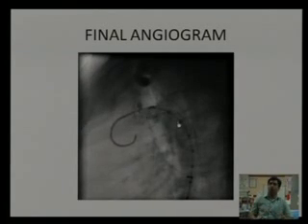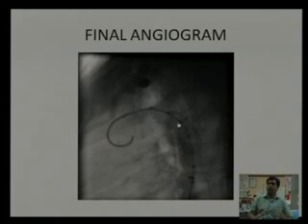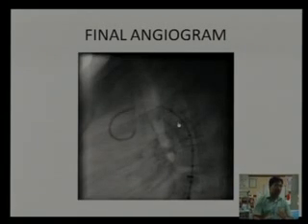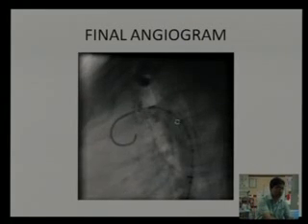That revealed a very good flow across the stent, and after that we checked the gradient across the ascending aorta and descending aorta. There is only a 5 gradient across that, but when we measured from the descending thoracic aorta to the abdominal to the femoral artery, we got a gradient of 30. So that suggests that the abdominal segment, across the perirenal artery, is also significantly stenosed. So we thought we can do that after some time with the graded approach.